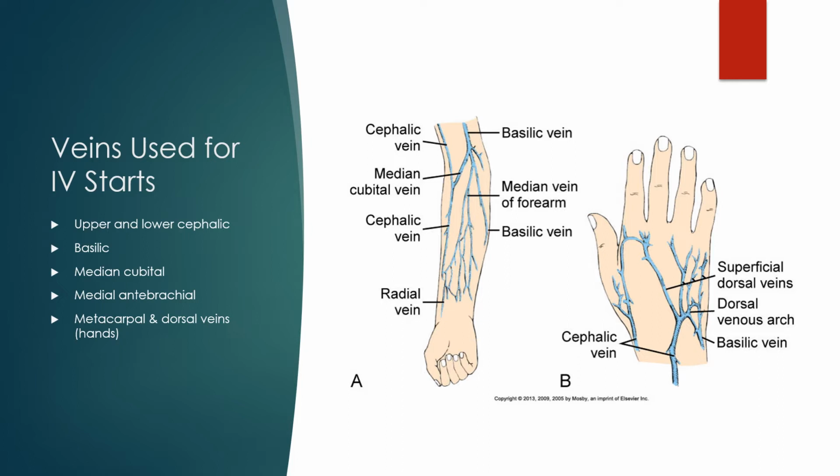If I do use the hand, there are some good veins. There are some things to worry about. You can see the bifurcation in the veins. This is where the vein splits.